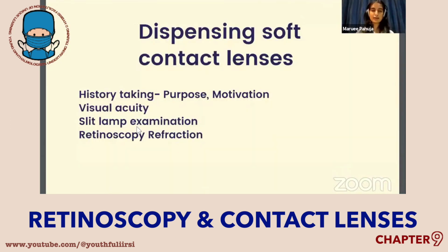There are a few steps and guidelines I will be taking you through to understand how we dispense soft contact lenses. Where do we start? And how do we go about it? So starting with, I think the most important factor is history taking, just to understand the purpose and the motivation for why the patient really wants to wear contact lenses. Is it an occasional wear, so a daily disposable lens would be better? Is it that they want to play sports? Or is it that it's just for an aesthetic improvement in a certain way?